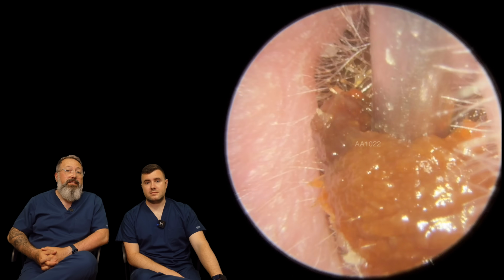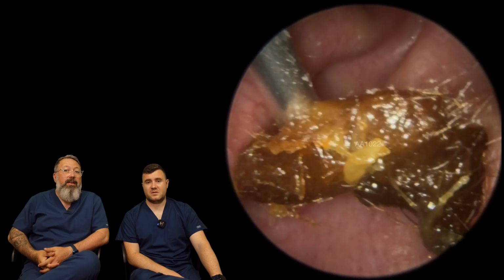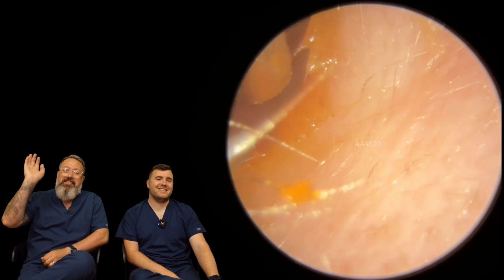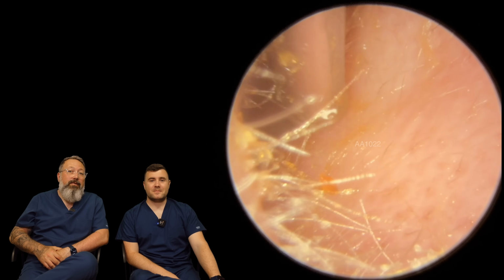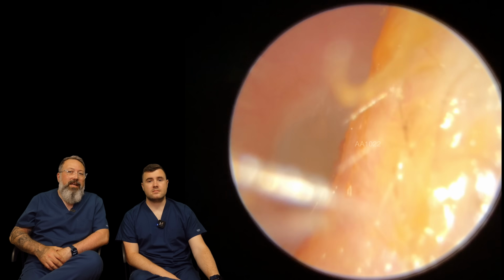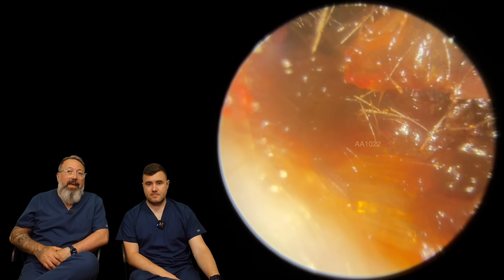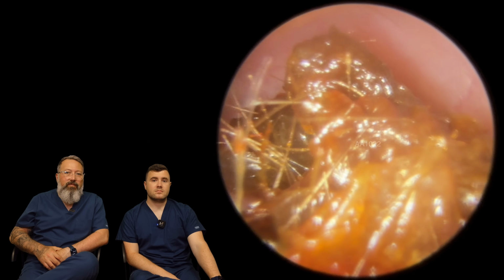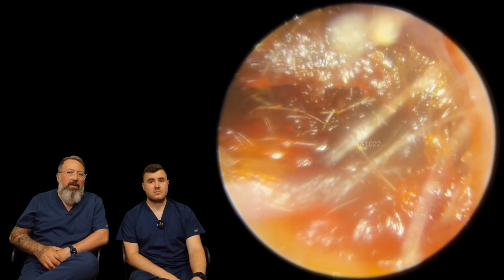And you can see this one's my patient, and we've got this lovely wax right at the entrance to the canal. It's finished already. Super duper easy, done and dusted. Just a bit tidied up now around this. So we do clear out the other ear canal as well, but looking lovely and healthy. Textbook eardrum there, and with this one very similar, very dry. You couldn't tell quite how deep it went, so we're going to get this out as well.